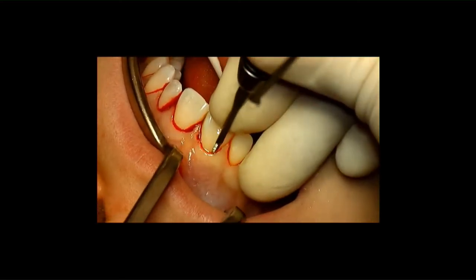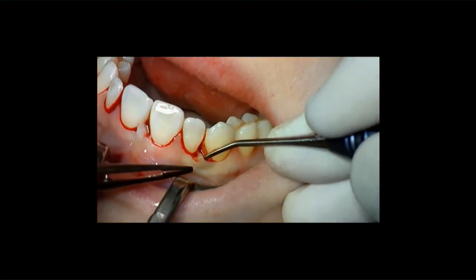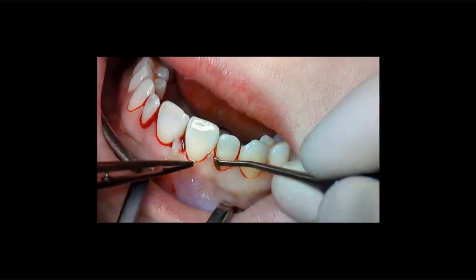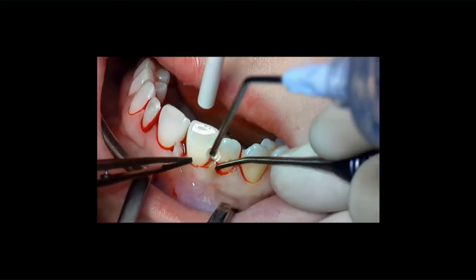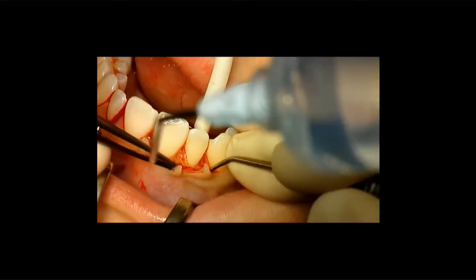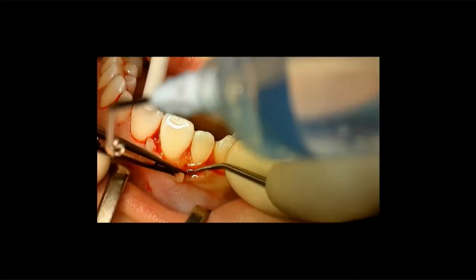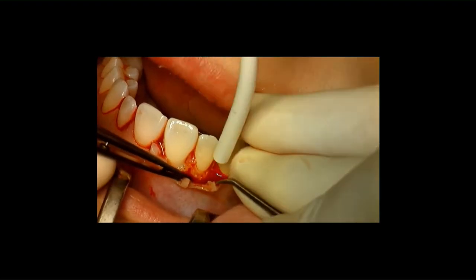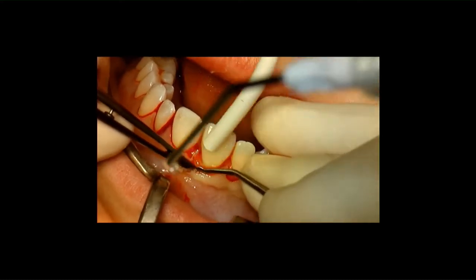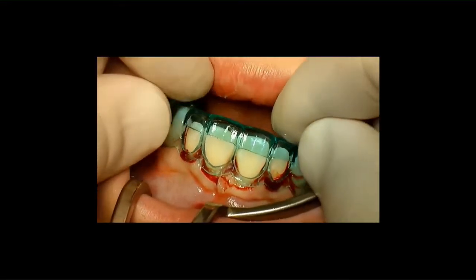It's always great to have one of your nurses keeping the area wet the whole time to keep the soft tissue really flexible. I will be releasing a micro scalpel holder that actually sprinkles water by itself next year, and that will reduce the cost by one employee in my office. So this is really tiny surgery. We only raise the flap minimally on the buccal side, of course. I use the microsurgical instruments from Suhr and Hürzeler, and I think they work great.